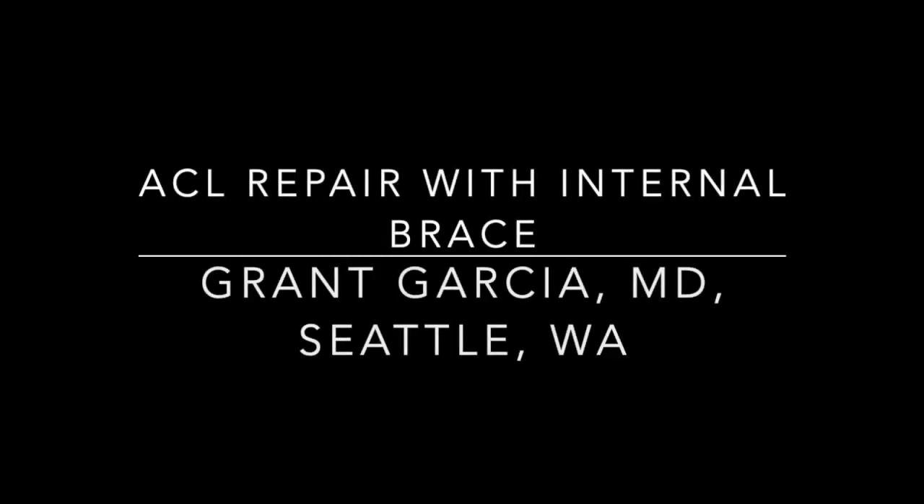Today we're going to demonstrate our technique for ACL repair with internal brace. This includes some updates from our previous technical video, incorporating our gained experience.